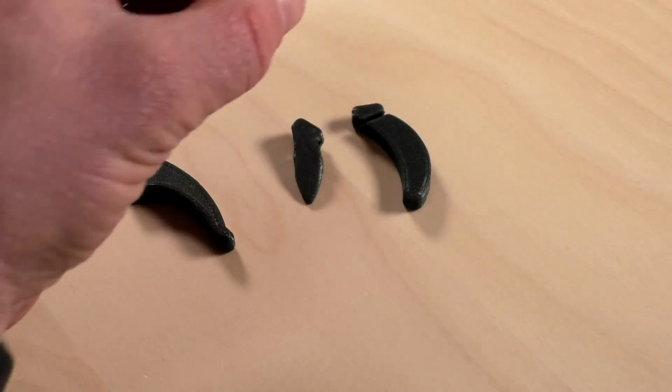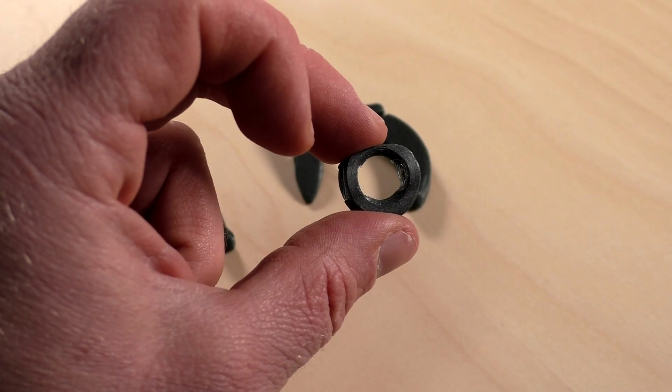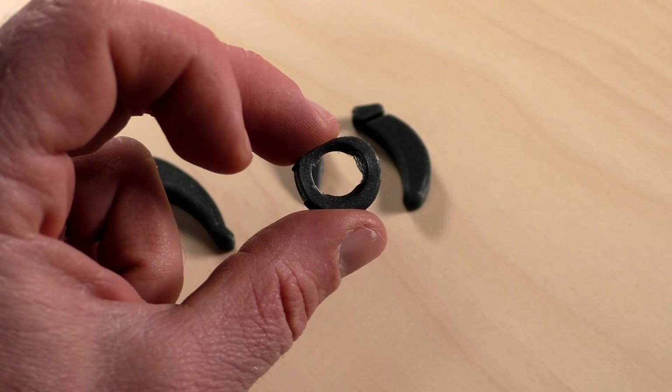This one is my favorite though. It's smaller and less visible, doesn't hurt your ears, and it's easy to remove. I'm using only this one now.